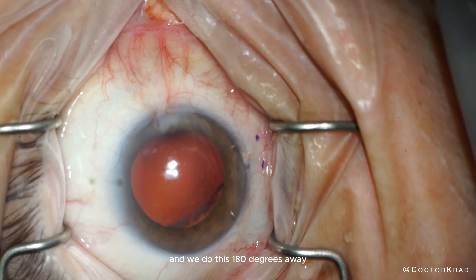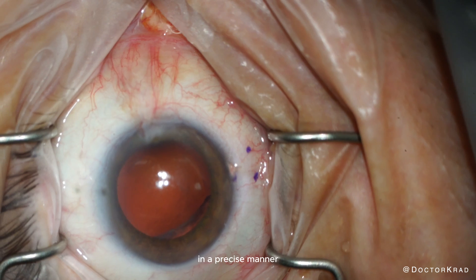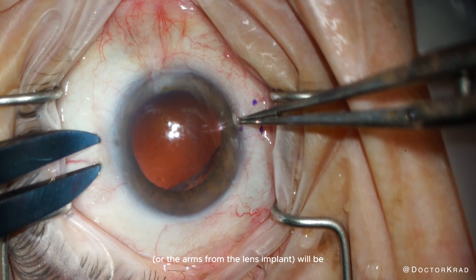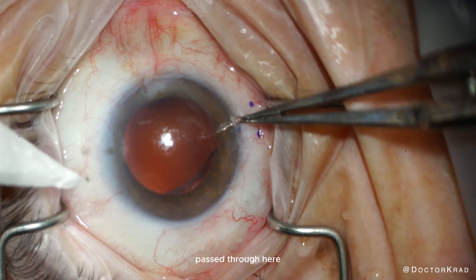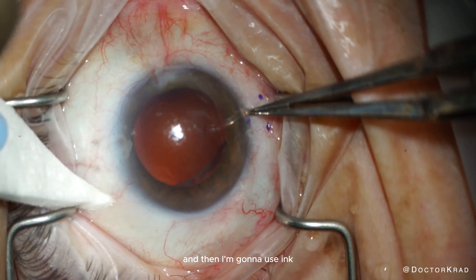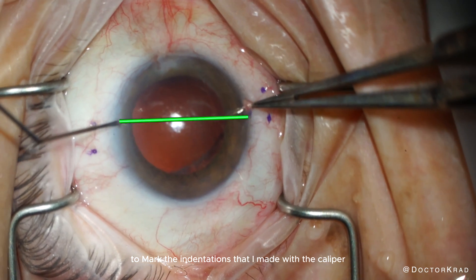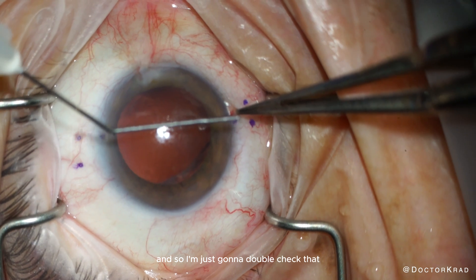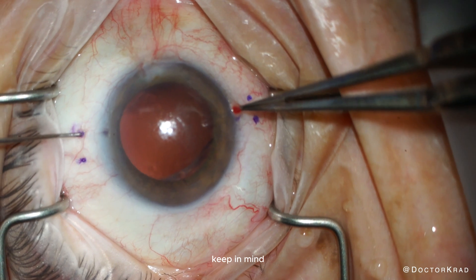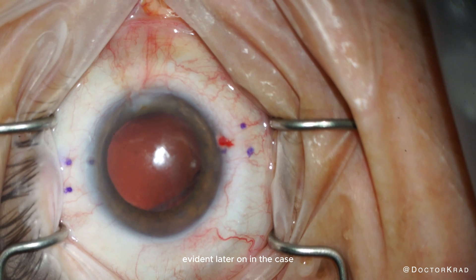And we do this 180 degrees away. It's very important to place these marks in a precise manner, because this is where the needle passes will go as the haptics — or the arms from the lens implant — will be passed through here. I'm drying the conjunctiva and then using ink to mark the indentations made with the caliper. Keep in mind the conjunctiva can move, and this will be evident later in the case.